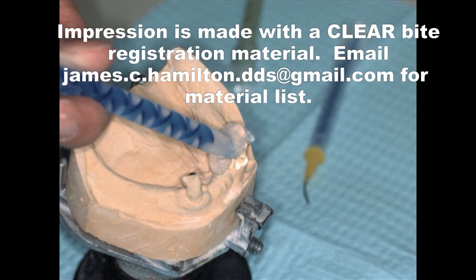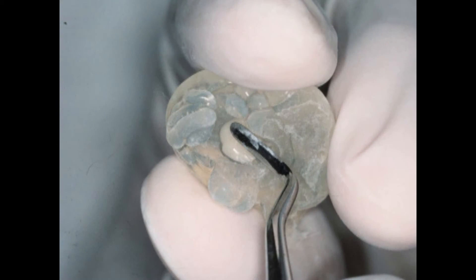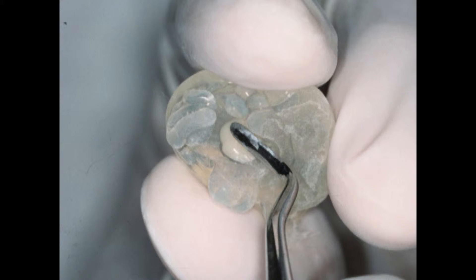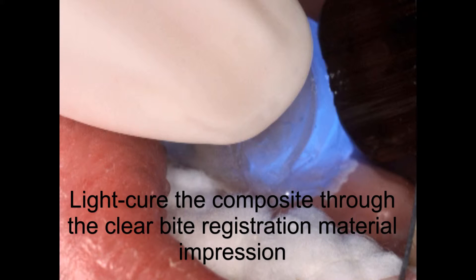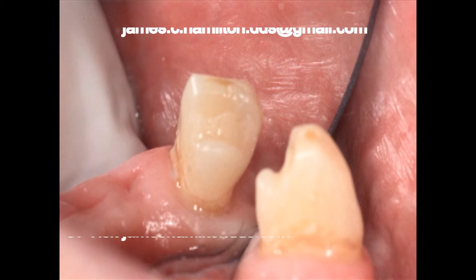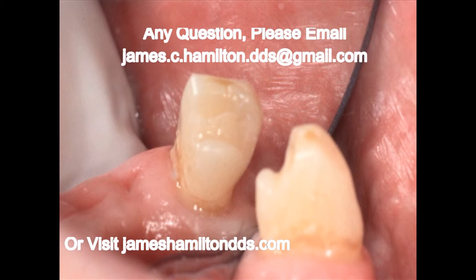Then you take your composite and pat it into the area where the wax is. It's good to look at the study model to see how much wax you had to make that rest seat. We take a comparable amount of composite and pack it with pressure into that area of the impression. We then seat that with pressure, hold it with pressure while we light-cure it — and here's our rest seat.